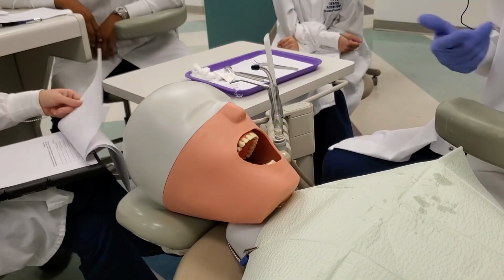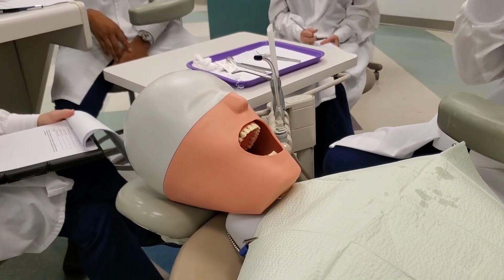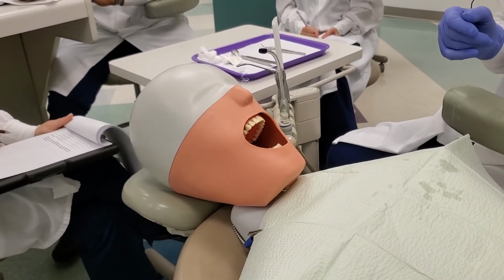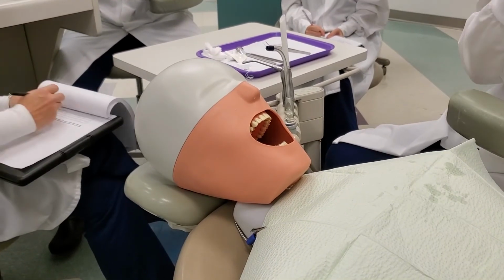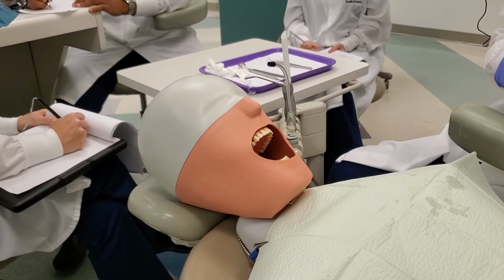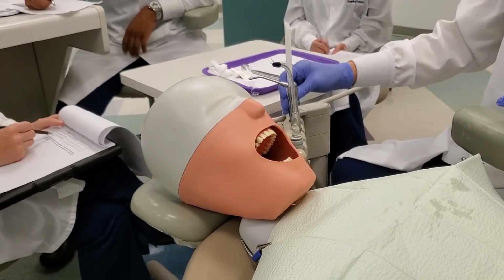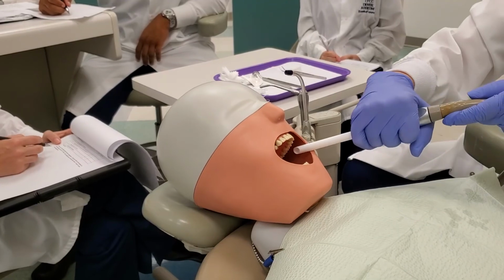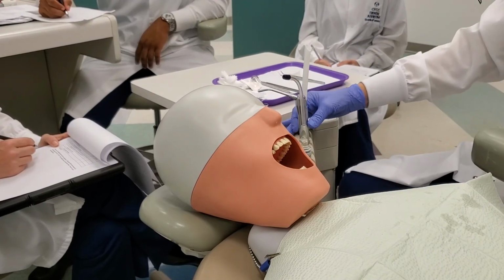What I will be looking for during all of this is for you to avoid suctioning tissue, okay? And you'll hear it. If you're walking by, everyone will be like, you're suctioning tissue. Place the bevel one tooth posterior to the tooth being worked on. Okay, so if I give you a tooth number, I'm going to be watching to see where you're placing this. It needs to be one tooth posterior to the tooth that we're working on. And making sure that that beveled edge is parallel to that tooth. Okay, because if it's up like this, you're not going to be suctioning up the water. If it's like this, that water's going to go straight. That's why you have to keep it like this. You have to keep it facing that tooth, looking at the tooth.